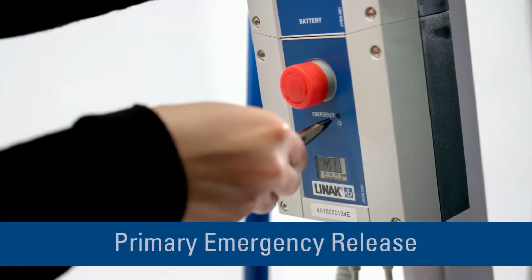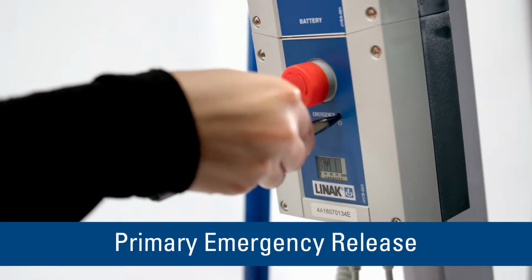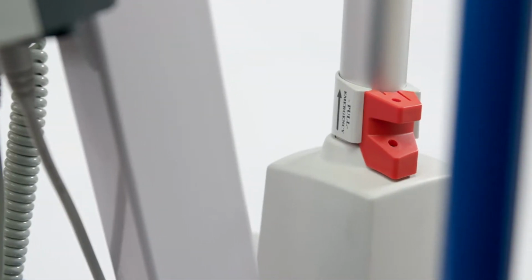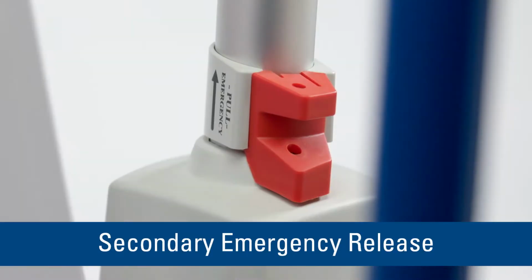To activate the primary emergency release, insert a pen into the hole labeled Emergency on the control box of the lift, and push down on the boom at the same time. Please use caution when using the secondary emergency release, as it is a backup that should only be used if the primary emergency release fails.